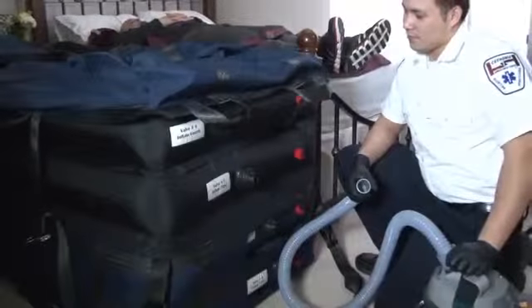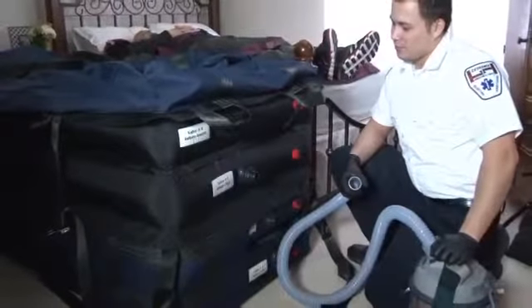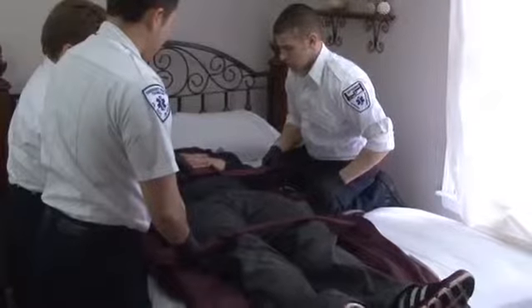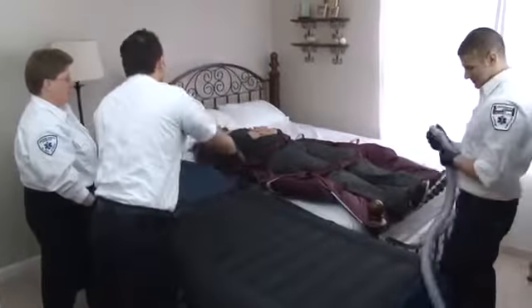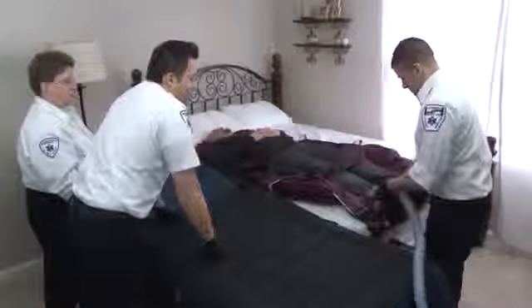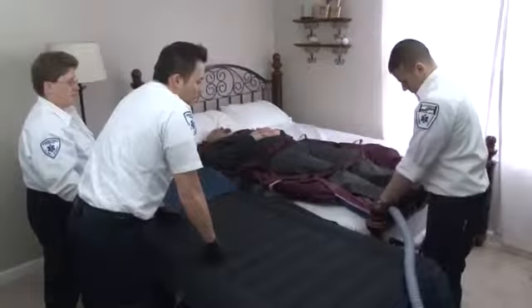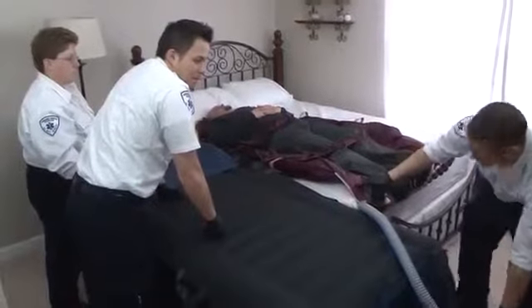Position the Evacuation HoverJack 2 as close to the adjacent transfer surface as possible, making sure that the foot pouch is unzipped and the safety straps are out of the way. At least one crew member should be next to the patient, while another is positioned against the device on the receiving side. Inform the patient what they will hear and experience while being laterally transferred from the bed onto the Evacuation HoverJack 2. Insert the air supply hose into the HoverMatt air transfer mattress, snapping the hose in place and securing the Velcro flap. Press the power button on the air supply to initiate airflow and inflate the HoverMatt.